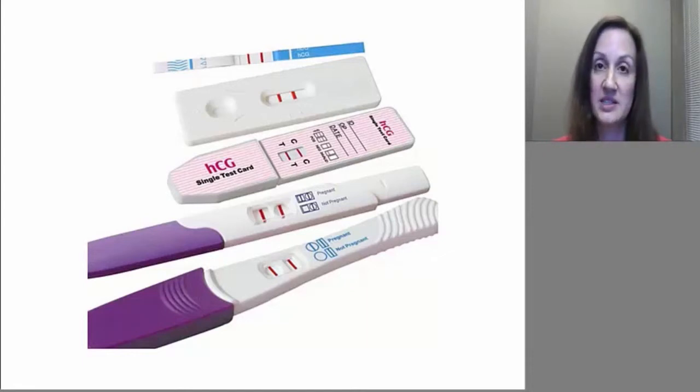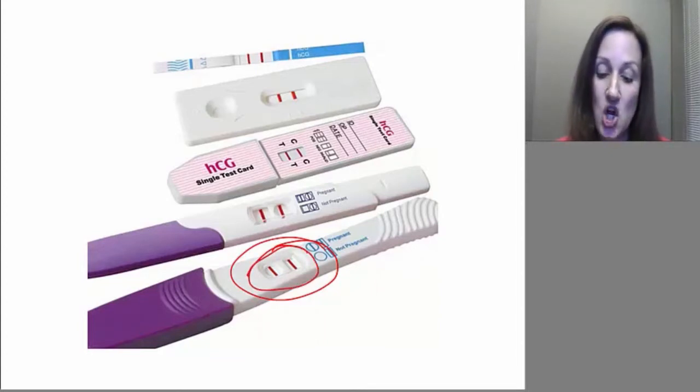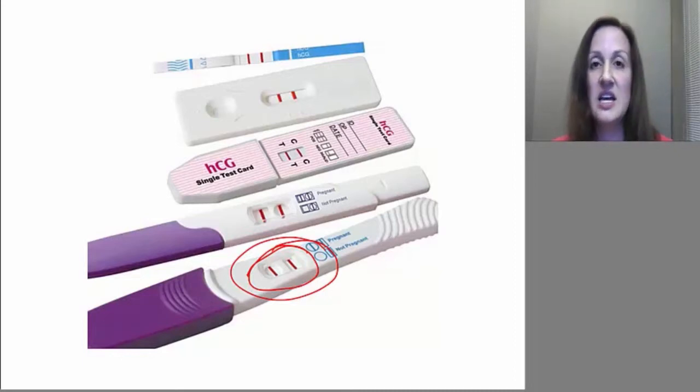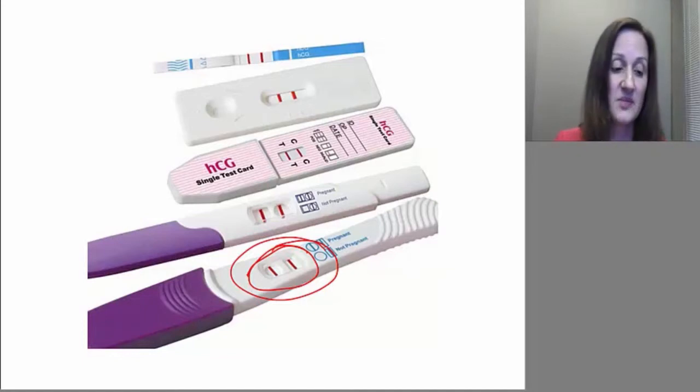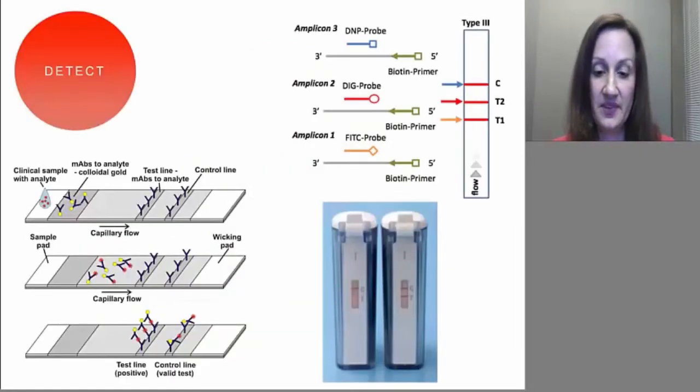The great thing about pregnancy tests is you can read them out on a strip. The second great thing about these pregnancy tests is that you can read them out on the strip and everybody knows what they're looking for. They're looking for a little red line. They're looking for a little red line in the window. If we can translate amplified nucleic acids into a signal that looks like the output of a pregnancy test, I think we have a very good chance of getting our tests adopted in low resource settings.